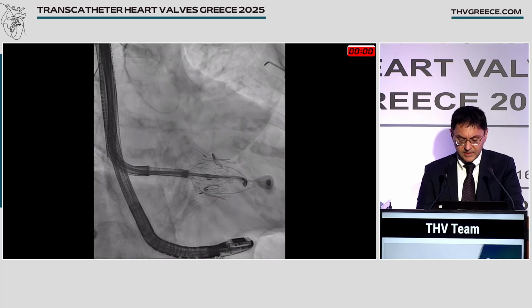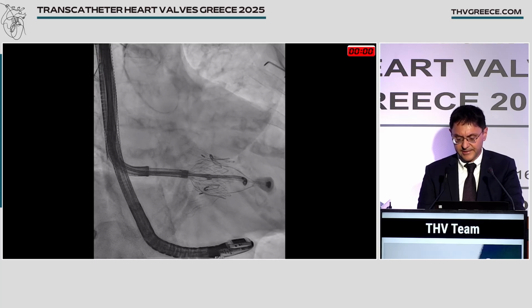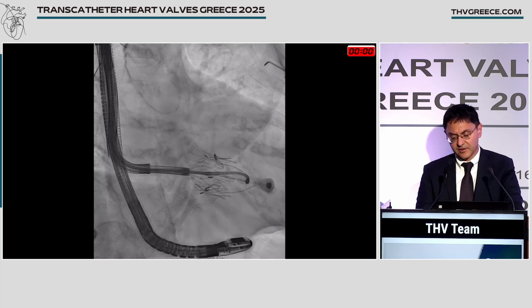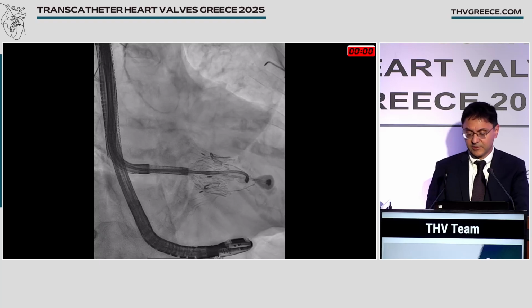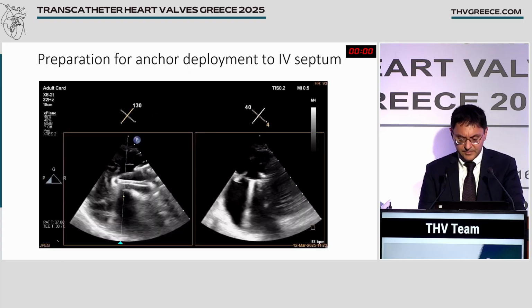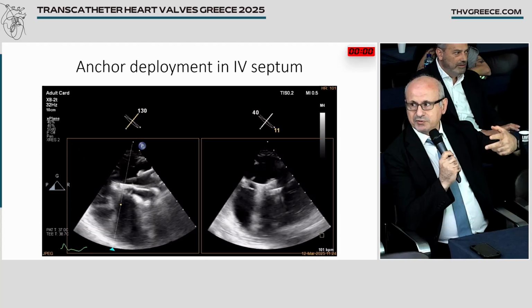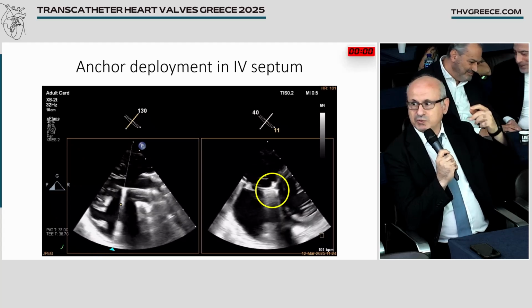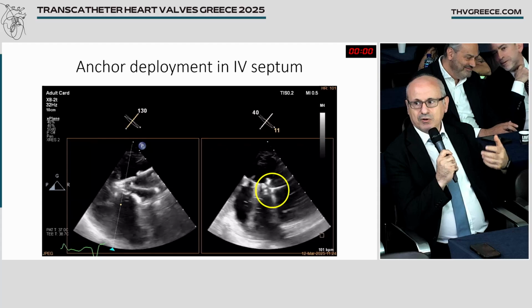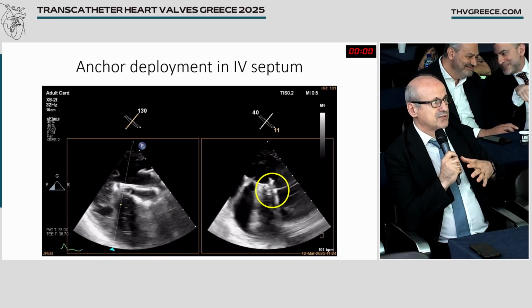Yeah, this is what we presented, and here we see nicely fluoroscopically the tube, as we said, orthogonal to the membrane of the septum. And here are the hooks, the 3 nitinol hooks, which are fired through just pressing a button on the delivery system. So this system has 2 passive components of anchoring, which are these rabbit ears, and 1 active component, which is the hook that is pinned into the septum, and also the atrial flange, which is also a passive component for anchoring and stabilization.